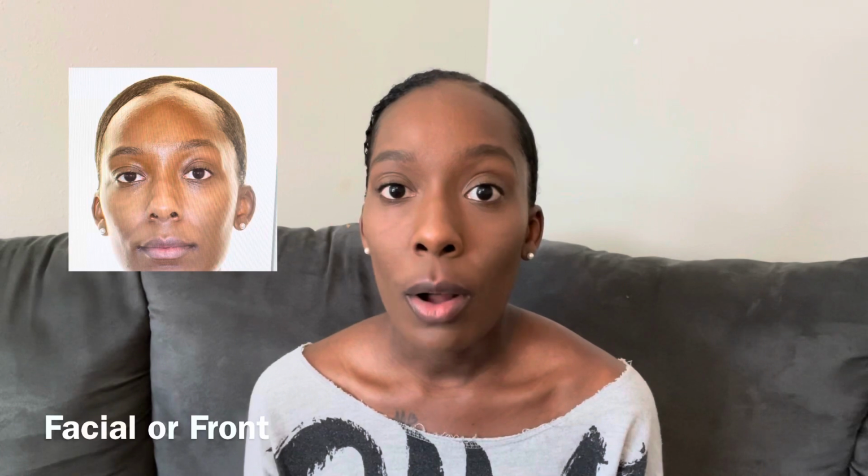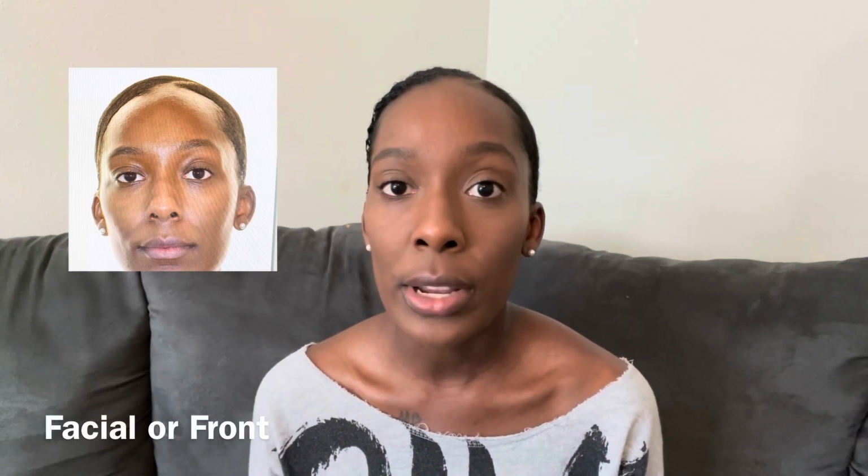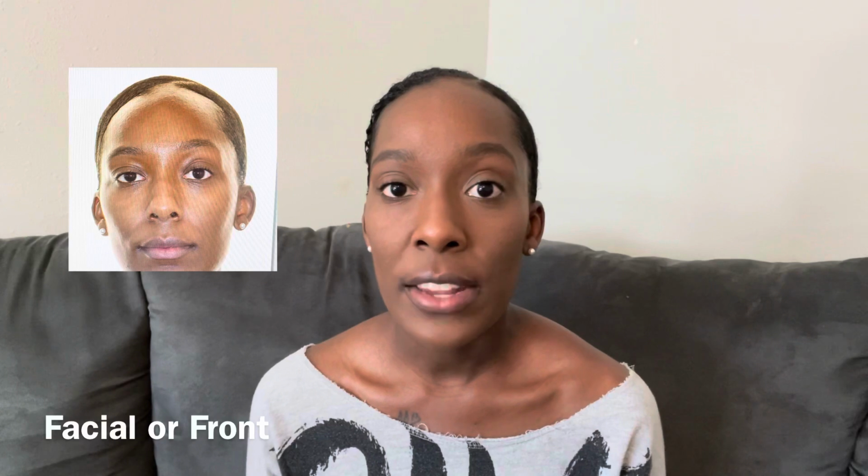The first set of images are called the extraorals. And these extraoral images are just images of the patient's appearance and their profile. The first extraoral image that is taken is just a straight-on shot. Some people call this the front. And in this image, the patient is looking straight and not smiling. So the orthodontist just wants to see exactly how the patient's face looks, just looking straight ahead.